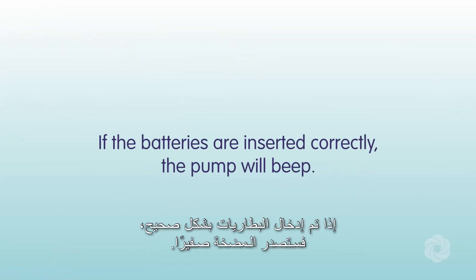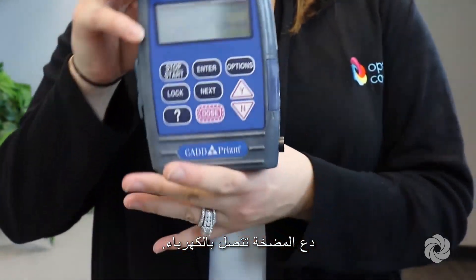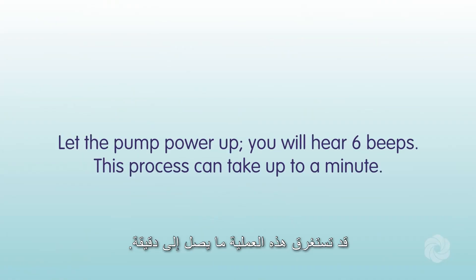If the batteries are inserted correctly, the pump will beep. Slide the battery door back on and let the pump power up. You will hear six beeps. This process can take up to a minute.